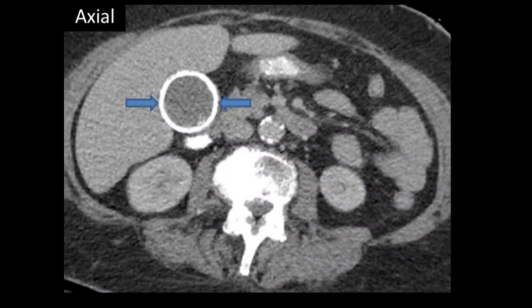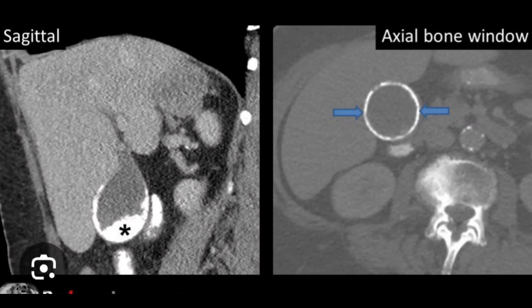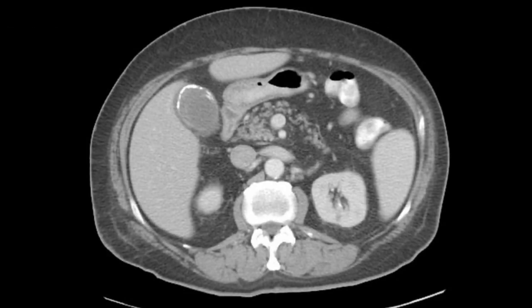On this CT axial image, you can appreciate how beautifully porcelain gallbladder is picked up — the entire wall is calcified and clearly visible. On the sagittal and axial bone window images, the case is still clearly visible, and you can appreciate the thickness of the calcified wall. Because of this wall thickening, there may be a chance of developing carcinoma, so you have to advise further workup and cholecystectomy.